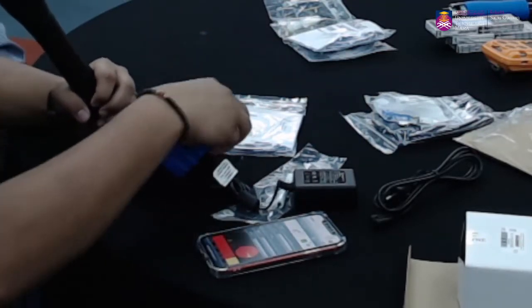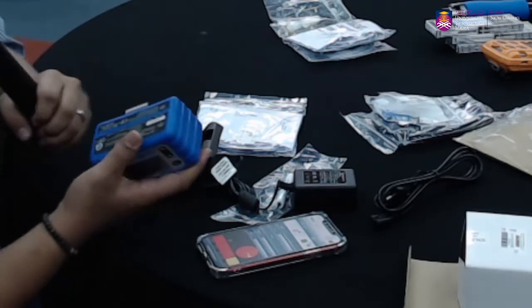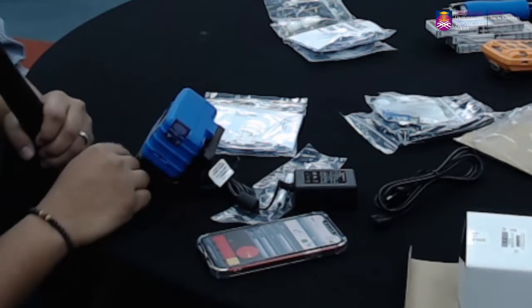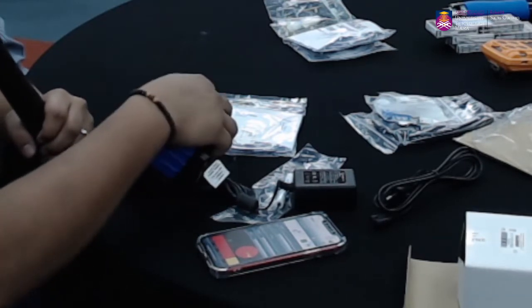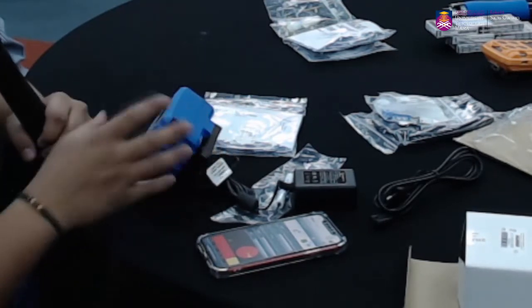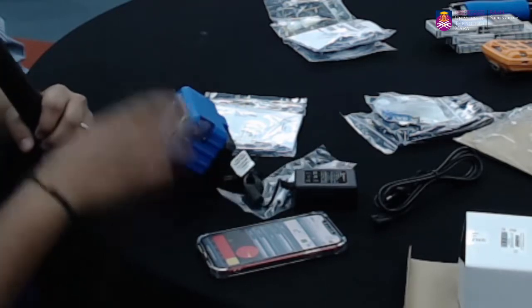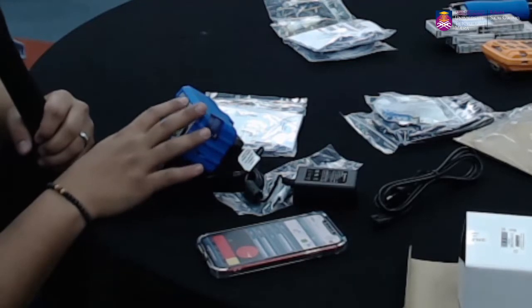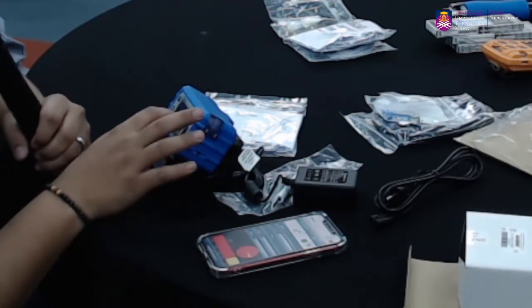So means that kita punya belting clip ni is actually kita punya slide untuk kita masukkan kepada kita punya docking lah. So once kita hear the click and then dia macam tight kan, so means that dia dah boleh start charging lah. Kalau kita tekan charging pun, kita masukkan pada plug, nanti dia akan blinking green juga, and then dia bagi tahu that the pump is charging lah.